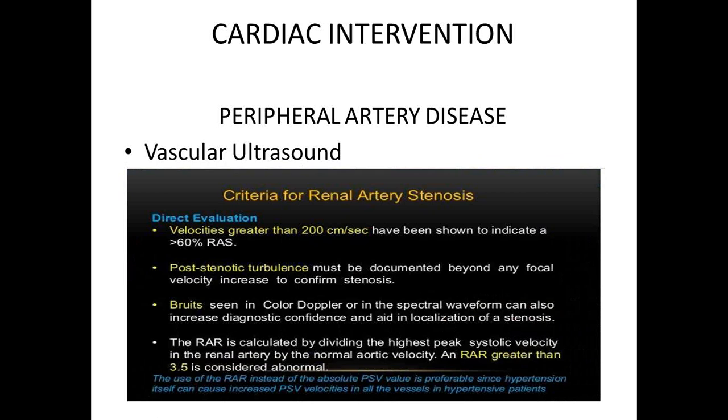You can look at the common iliacs, the external iliac, and the common femoral. You can look at the superficial femoral, the deep femoral, and then the popliteal system. So you can look at all those arterial beds.